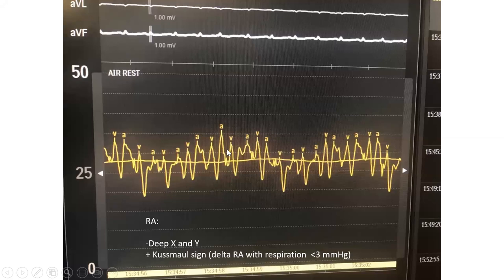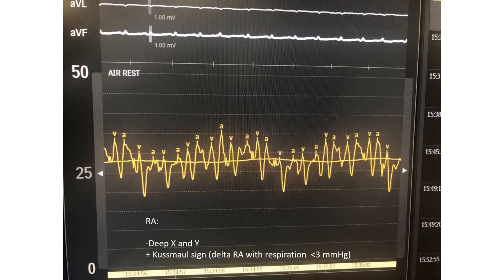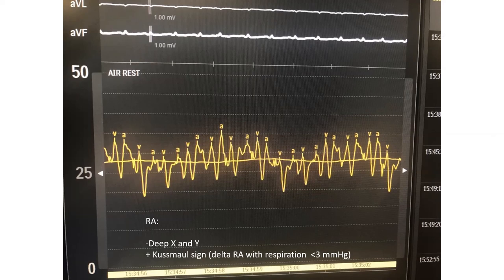Moving to invasive hemodynamics: in constrictive pericarditis the RA pressure tracing shows two things — first, it is elevated; second, it has deep X and deep Y descent. Deep Y is particularly prominent during inspiration, because in inspiration you fill more so pressure shoots up and then down more steeply. This is a marker of loss of atrial compliance. It is seen in RV failure and restrictive cardiomyopathy as well — very sensitive but completely non-specific.